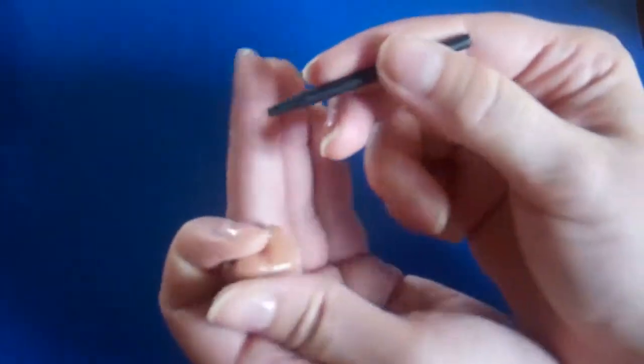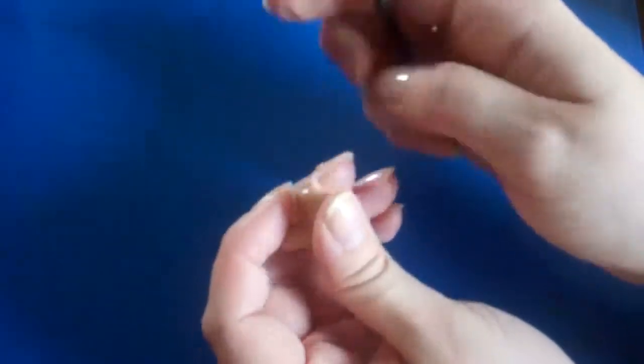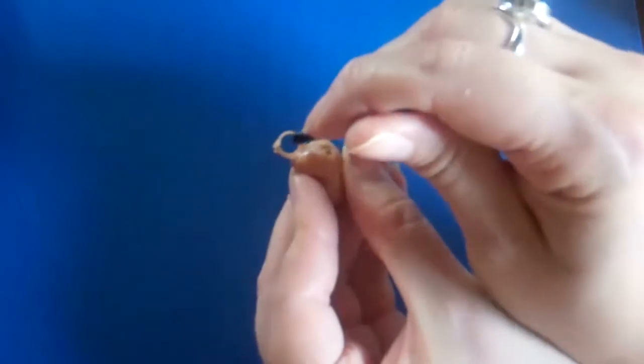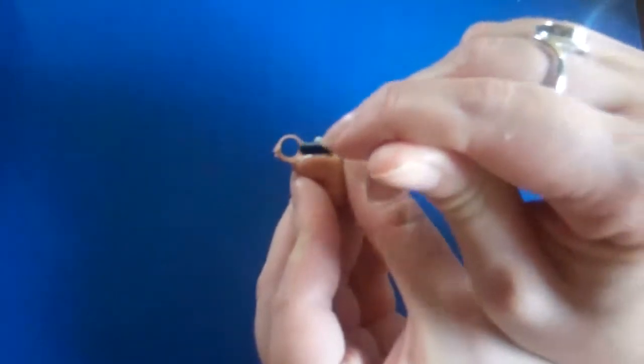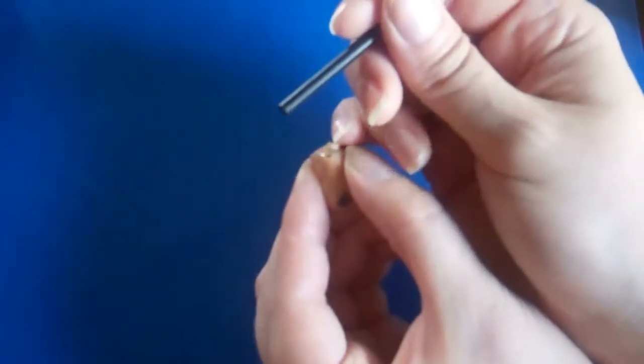Finally, you're given a little wire loop. On the opposite end of that loop is a magnet. The best thing about this tool is the magnet. What you want to do is take out or put in your battery with this little magnet tool. It makes it a lot easier to do.